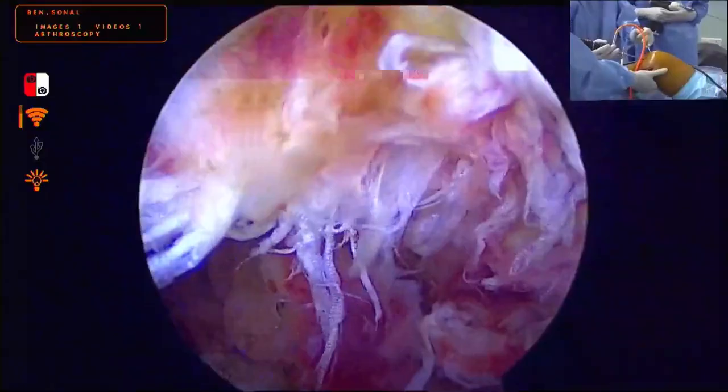Hold this, okay. Pull the wire one by one, slowly. Don't put more force. Pull it slowly. Hold the wires slowly. Hammer, please. So this is the push lock anchor, and this will be used to do a double row repair of the PCL femoral avulsion.